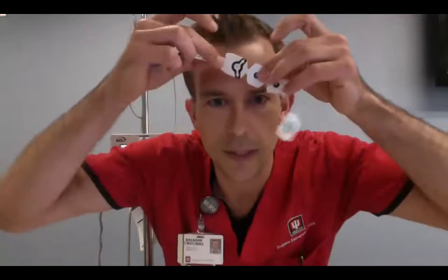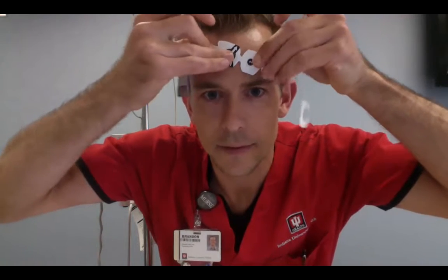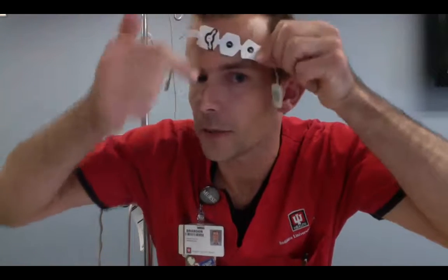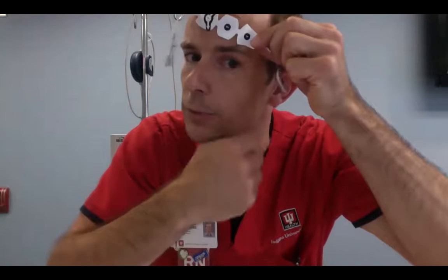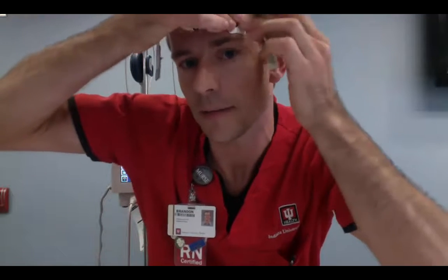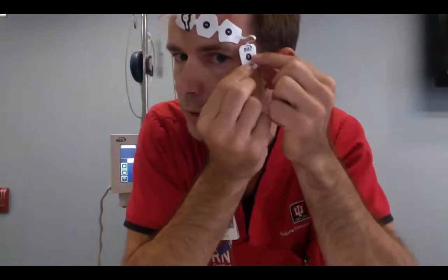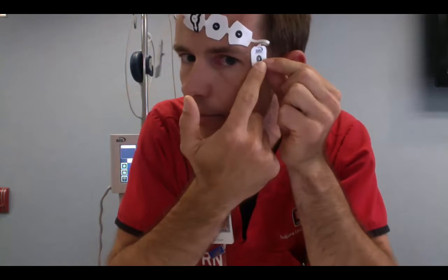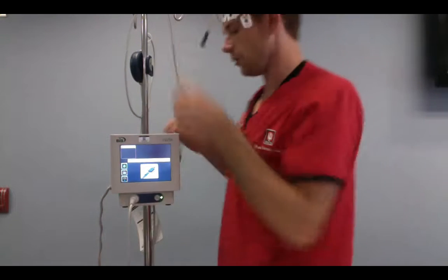So I'm going to place one here toward the top of my shiny forehead, pointing directly down. And then we have 2. And then we have 4, which you can see the curved pad, which will go directly over the outer portion of the eyebrow above it. And then you have number 3, that the blue circle, will go in line with the outer canthus of the eye. Now we're ready to plug it in.